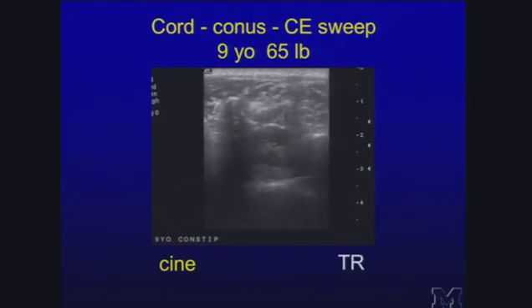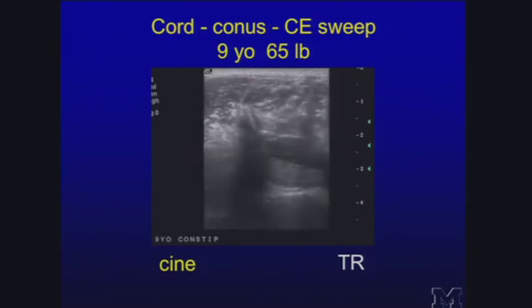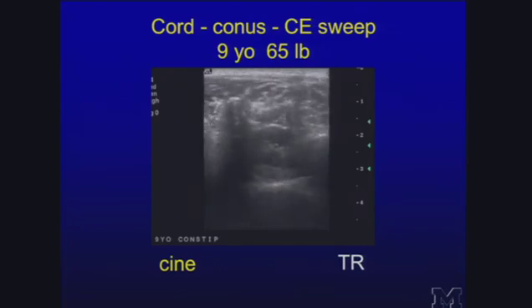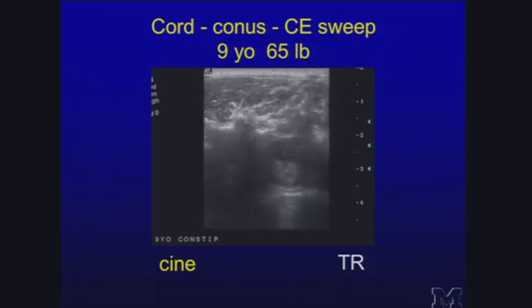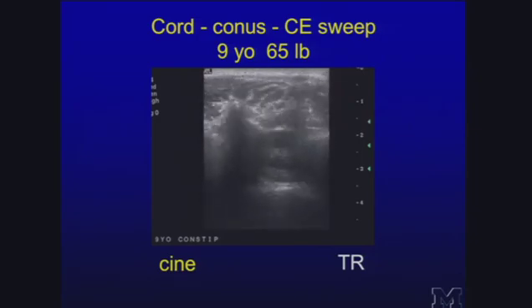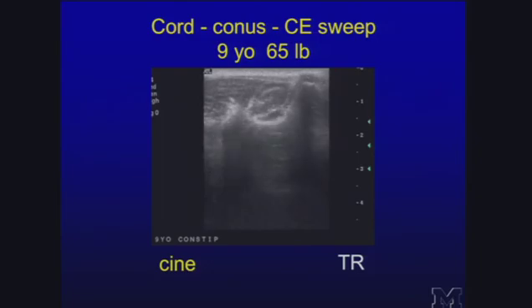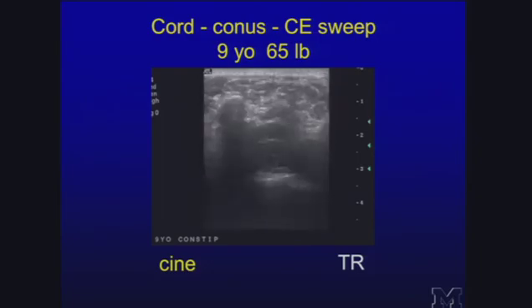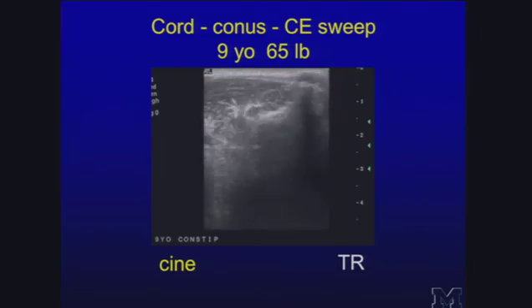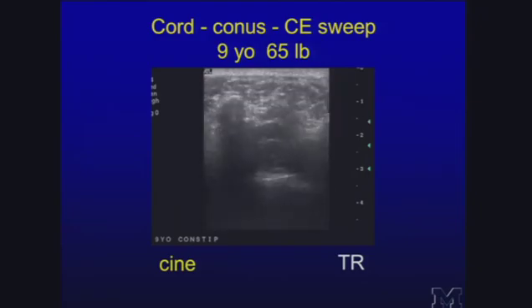Now this is the same thing in short axis, again at 3 levels. So like pictures we've seen before, you're going to see the hypoechoic cord in the middle, then you're going to see the cord being smaller, which is the conus medullaris going towards the tip, and then you're just going to see fuzzy roots of the cauda equina. So in a moment when I get in phase with it here, I'll call it out to you again. Cord, conus, roots. Here it comes again. Cord, conus, roots.